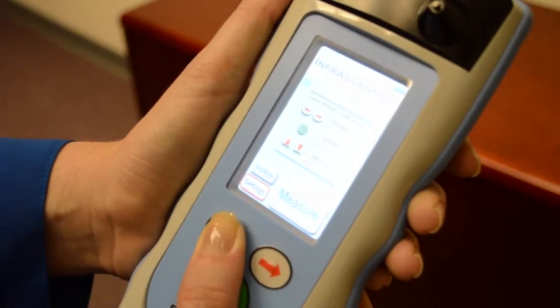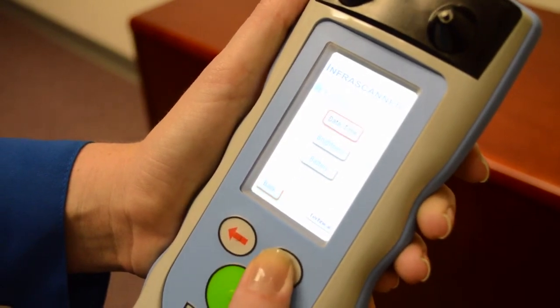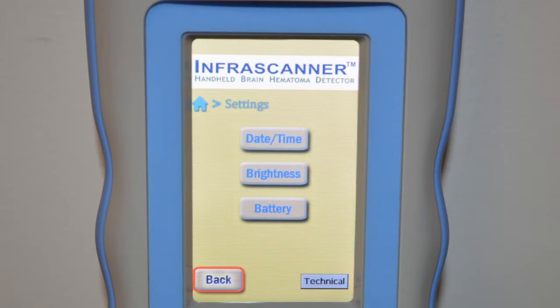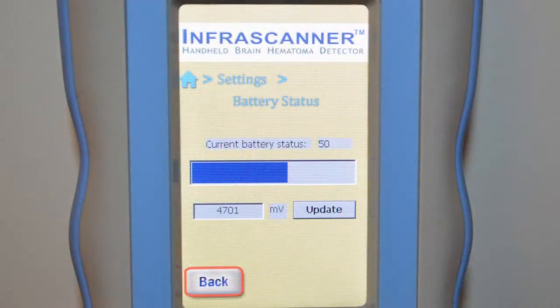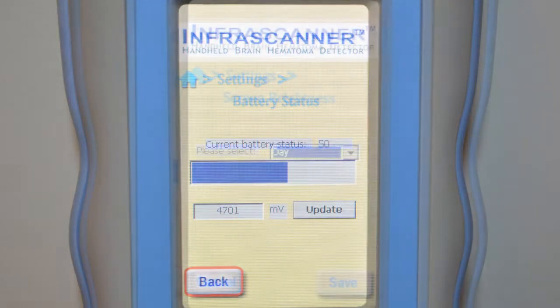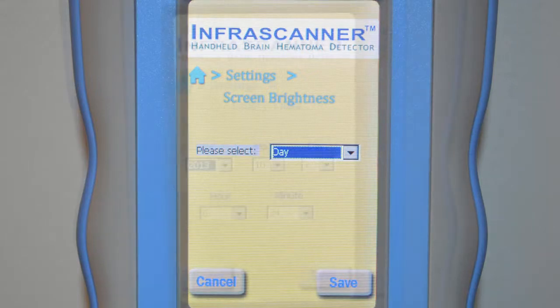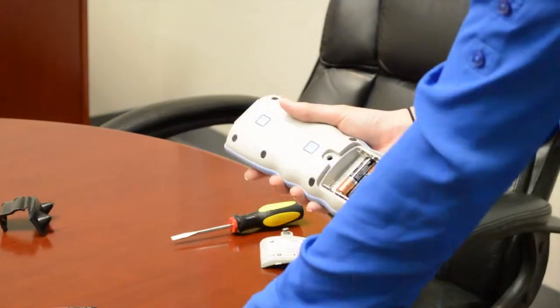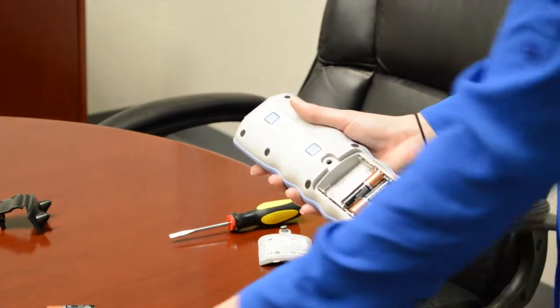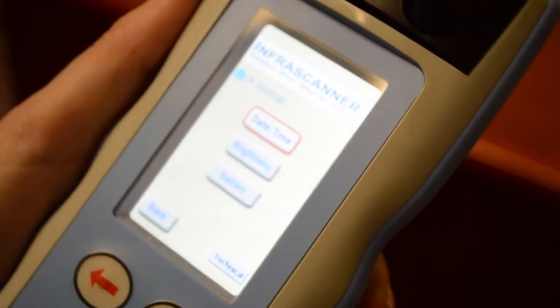Navigate to the settings screen using the left/right arrows and select it with the center green button. Three options appear: date and time, brightness, and battery. The battery screen gives the most accurate battery status. The brightness screen is a military application allowing you to select night or day mode using the up/down arrow keys. The date and time screen shows year, month, day, hour, and minute. When AA batteries are removed, the InfraScanner shuts down completely, and the user may need to readjust the time and date.